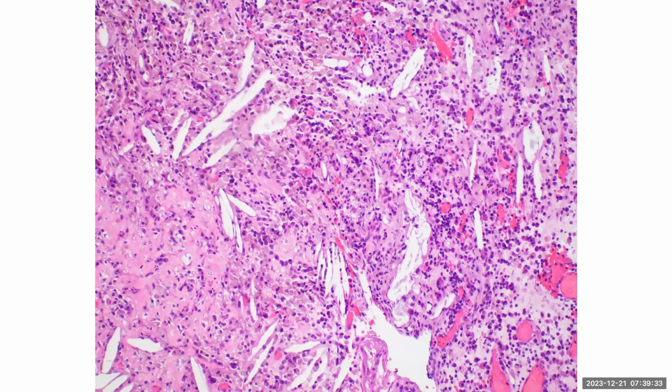Well, here you see a reactive environment where there is fibrosis, hemosiderin, a lot of macrophages and plasma cells and mature T cells probably. And then cholesterol clefts, these big elongated white optically clear areas. I would think that this would be either the contents, or if it's ruptured into the adjacent tissue, then you would see this kind of reactivity too.